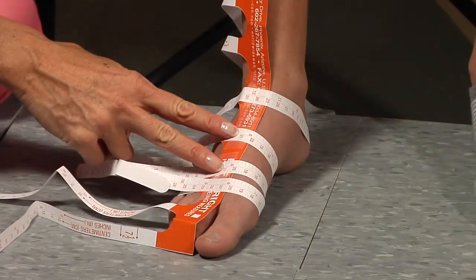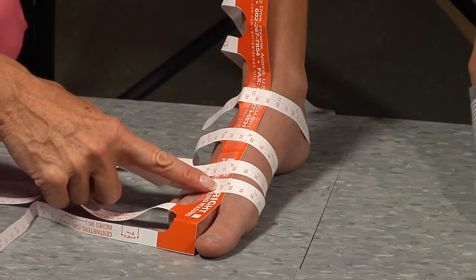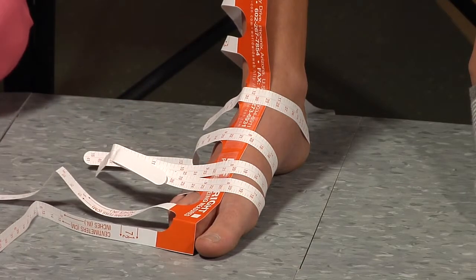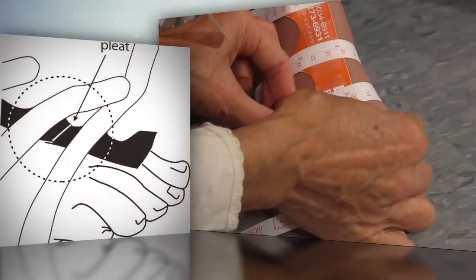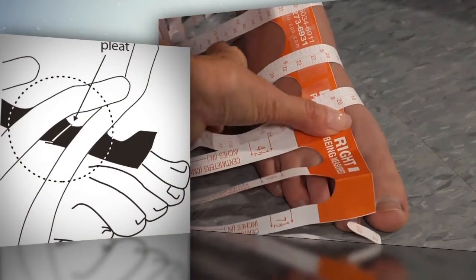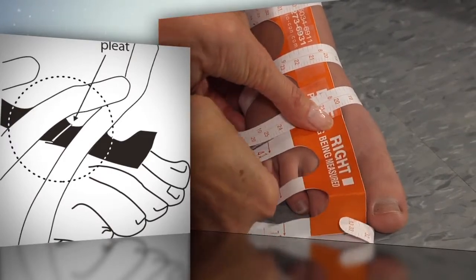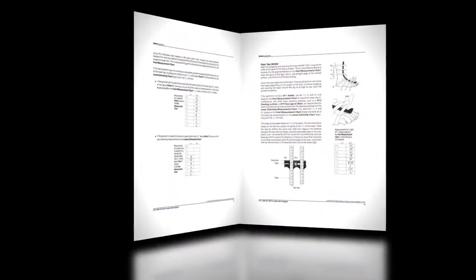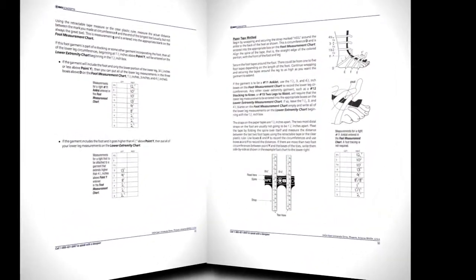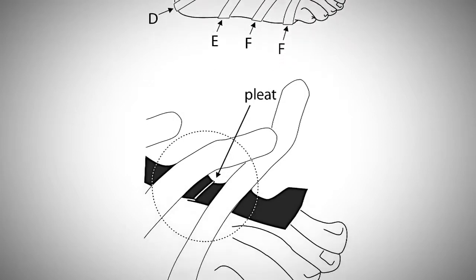Again, the straps on the paper tape are 1.5 inches apart. The 2 most distal straps on the foot are usually not going to be 1.5 inches apart. Pleat the tape by folding the spine over itself and measure the distance between the last 2 foot tapes using the retractable tape or clear plastic ruler. Refer to the measuring manual, page 56, for the procedure to record paper tape measurements of the foot on the foot measurement chart.